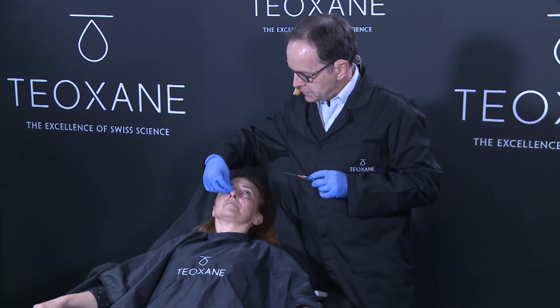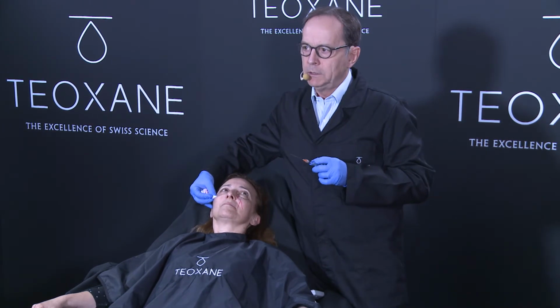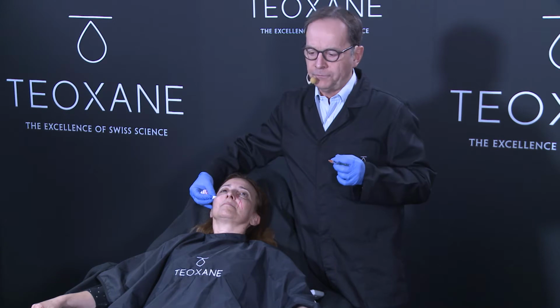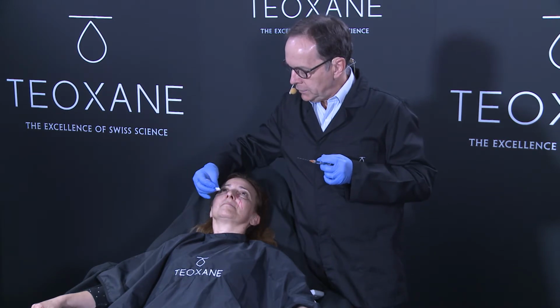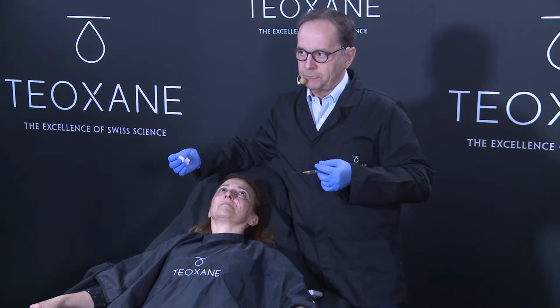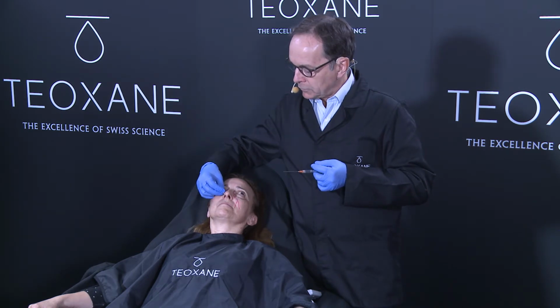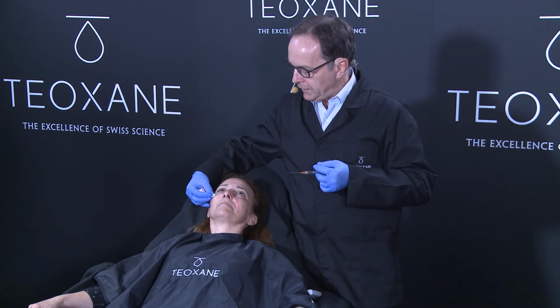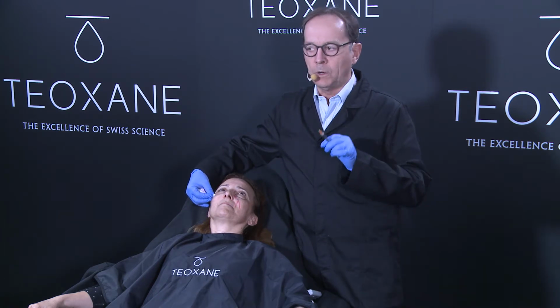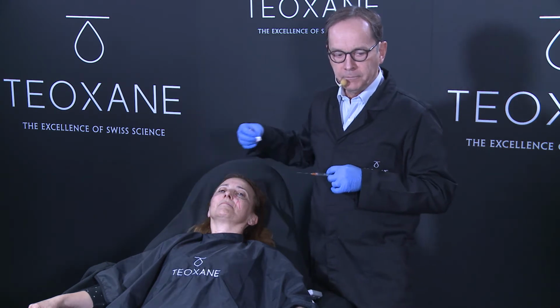Do you have any question? Because I think I have almost finished. So you see, it's easy, it's fast, it's safe, safety first, not a lot of product. So for you, it's not a huge amount of money. Sorry for the company. And so you can correct easily a face with small aliquots of product. It's okay? Any question?